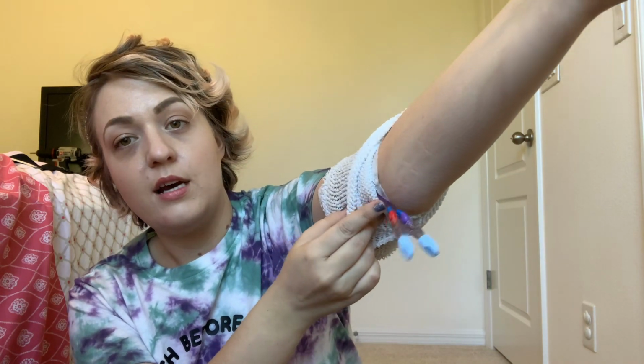So they have your arm out, and they use an ultrasound thing, so they can actually look directly in your arm and see which vein would be the best one to go for. So they get it and they mark it, and then they have this tube, like what you can see, like these tubes. This is exactly what it looks like when it goes in, like these purple tubes. Sorry, let me show you. That's what's inside of your body.